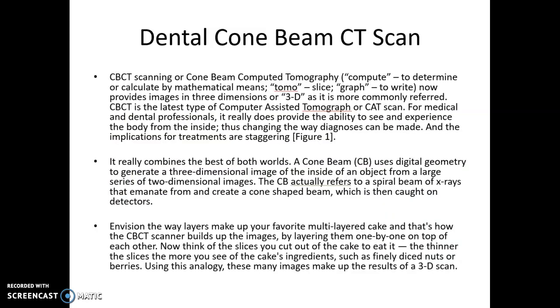Okay, this is kind of that same information. I've just explained it out a little bit more. CBCT just stands for cone beam computed tomography. It lets the computer create a 3D reference or 3D model of whatever you're taking a radiograph of. Everything else I think you can just read in there.